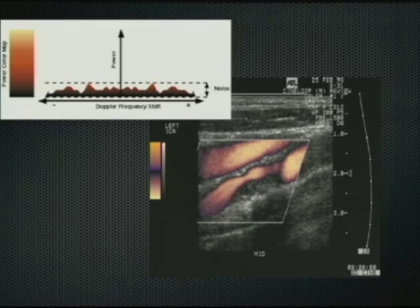This effectively allows us then to use much higher gain to detect Doppler information when we use a power Doppler display than would be possible if we were using a frequency display. This means that we can fill in vessels more completely, we can reduce noise in the image, but we pay a price in removing from the image the frequency information, which provides us information about the direction of flow and the relative velocity of flow, assuming that we correct for the Doppler angle.